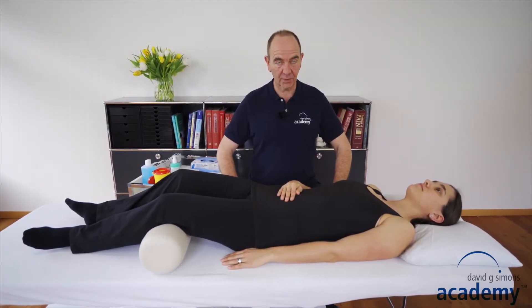Hello, I'm Christian. In this video I will show you the equipment that you need for dry needling and how to prepare yourself and the patient for the dry needling treatment. I'm sure that this workflow will help you for safety and effectiveness in dry needling.